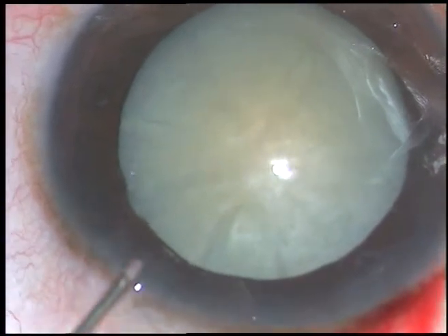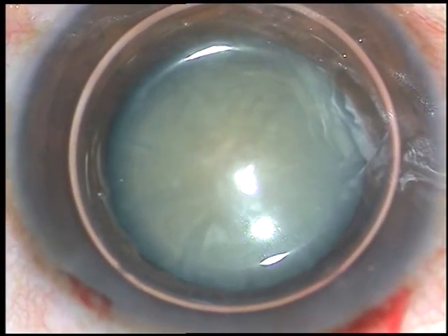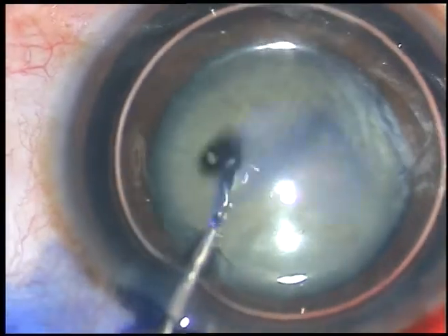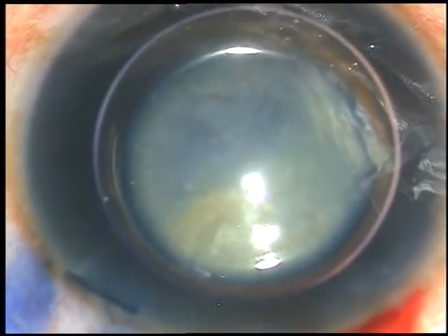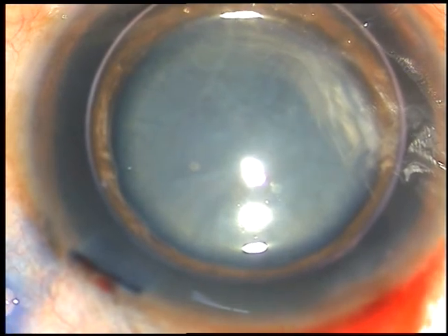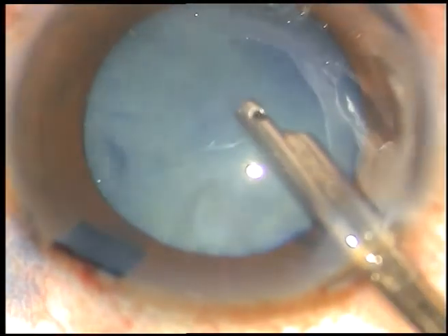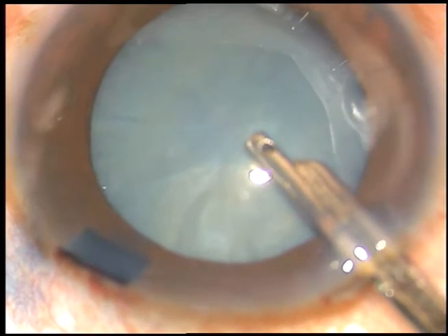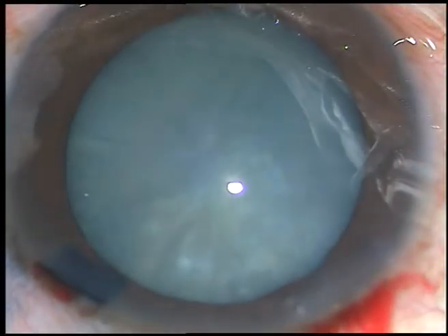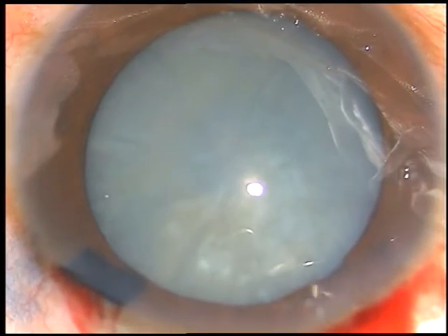In this case, the rhexis was on the smaller side. Let us see how I managed the case. This is a white non-intumescent cataract. I have made only one side port. I am staining the anterior capsule with trypan blue dye. Now the dye is washed out. The pupil has dilated quite well, but it is not fully dilated. The viscoelastic substance is injected.